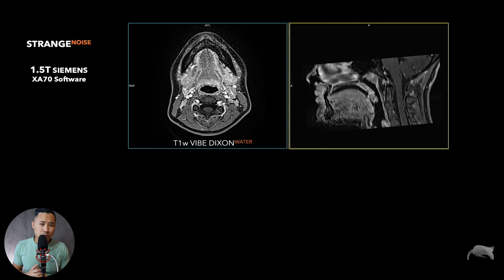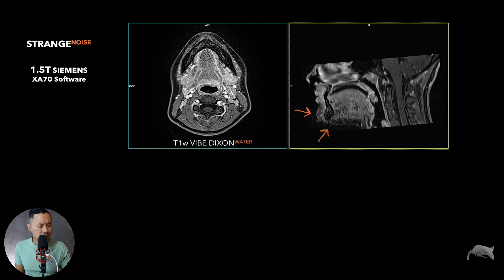This was done at 1.5 Tesla on the Siemens scanner software XA70. Like I told you in the beginning, this part looks strange. I was thinking about whether I needed more SNR, but then at the end you can see there's a lot of signal in the back and up top — but there's some noise kicking in the top there, while the middle is perfectly fine.